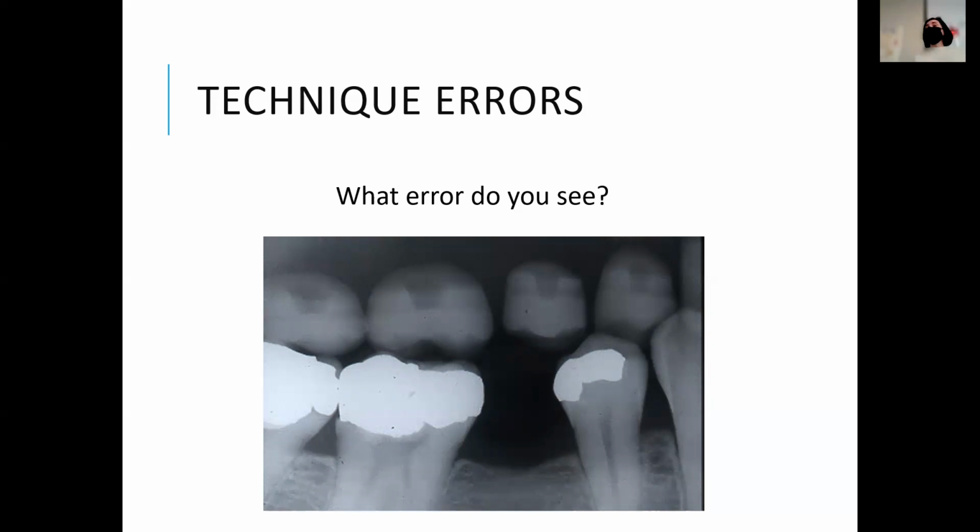Well, it's kind of funny because honestly, if you were taking a PA, you might leave the denture in there so the patient has something to bite against. I always took out the patient's denture, but sometimes it's really hard for them to hold the XCP. So I have had times when I've had them put their denture back in, but it's hard for them to bite hard enough.